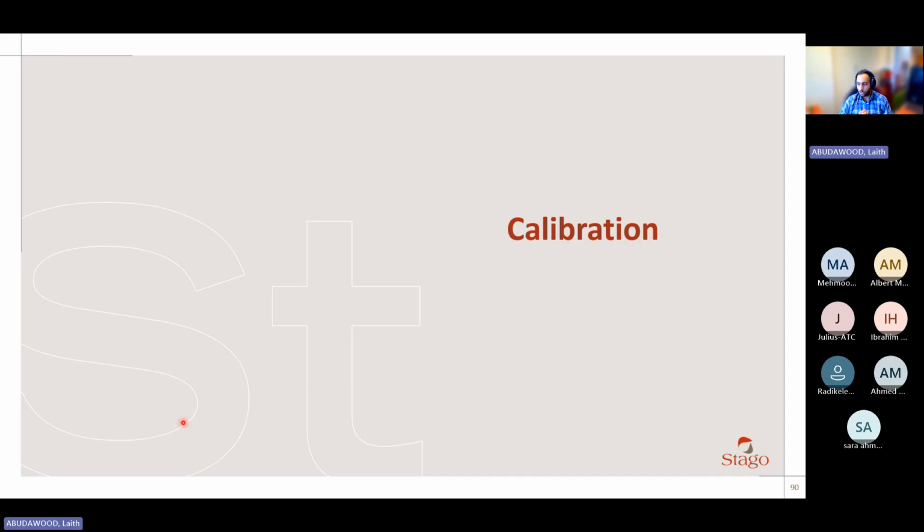Now the analyzer will be as follows. Okay, I got 40 seconds. I don't know how to convert 40 seconds into a concentration of factor 8. No one taught me how to do it. No one gave me the information how to do it.